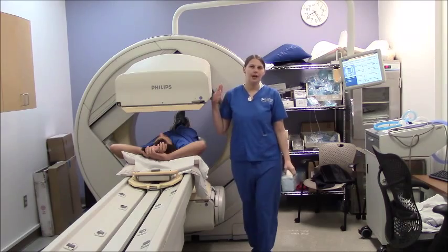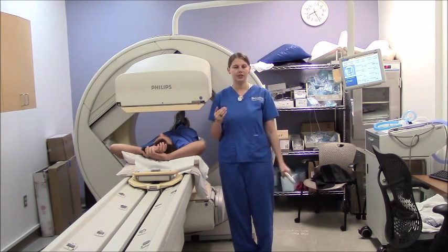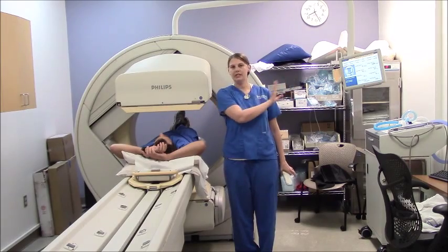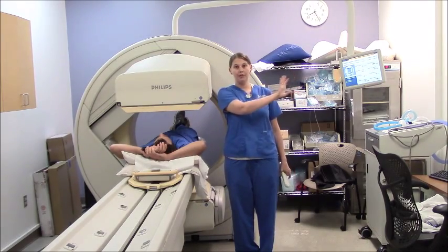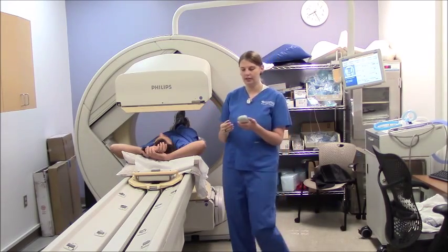Now that I've moved the camera heads away from the patient, I can now turn it to our next position, where we will look from the side, from the front side of one lung and from the back side of the other.